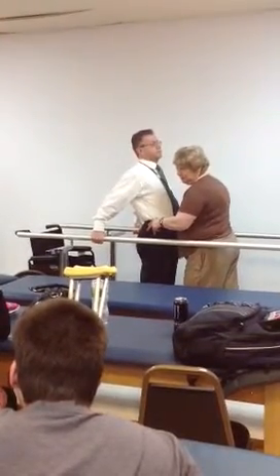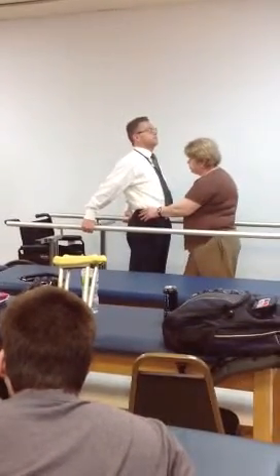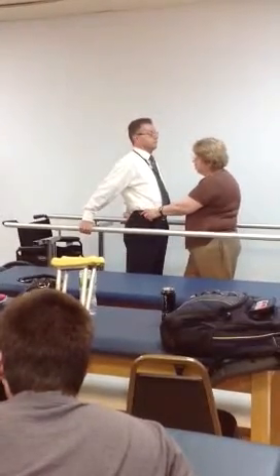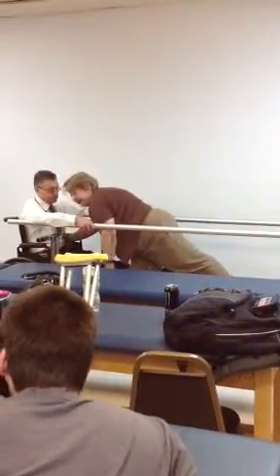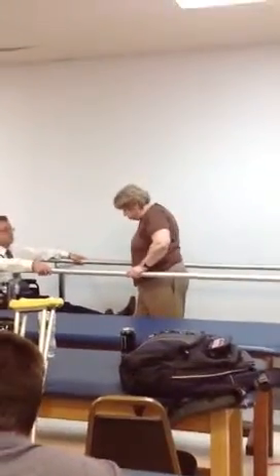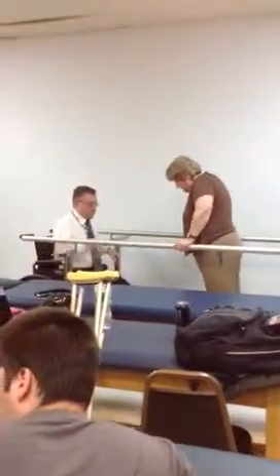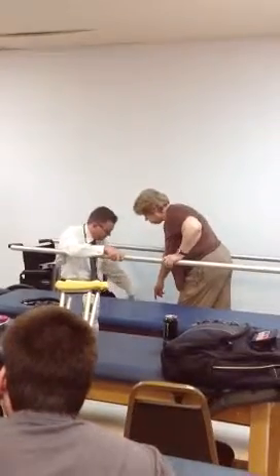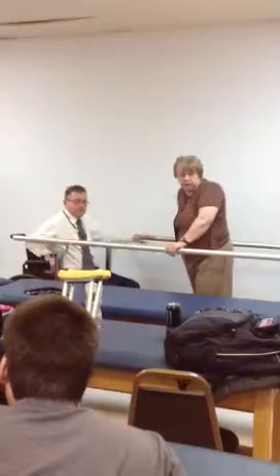Now here I have to be careful that when he comes down, I don't get kicked, okay? Because his legs are gonna come up. So I have to keep my distance, okay? So you're gonna tuck, and I'm holding on to his pelvic band, okay? Tuck and sit, okay? So if I'm right here between the legs, that's perfect, okay? And then, just come forward to the edge of the chair. Okay, push down on the knees and unlock. And then, yeah, bend them, and then you get back.